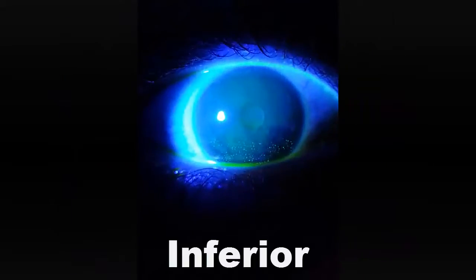We call this inferior staining. Why does this happen? Think of this like exposure keratitis — the inferior portion of the cornea is not being lubricated by the lids when blinking. How do you fix this? Re-visit your 3 and 9 o'clock staining techniques. We may have to look at the edge of the lens or consider altering the diameter.